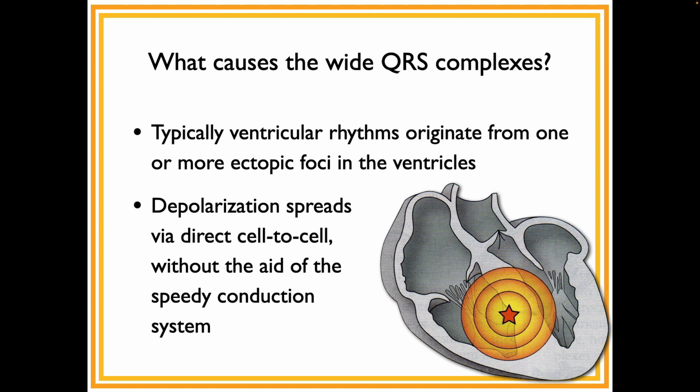For that reason, any ventricular rhythm that has an organized QRS, like VTAC, will always have a wide QRS, okay? Yes, any ventricular rhythm has a wide QRS.